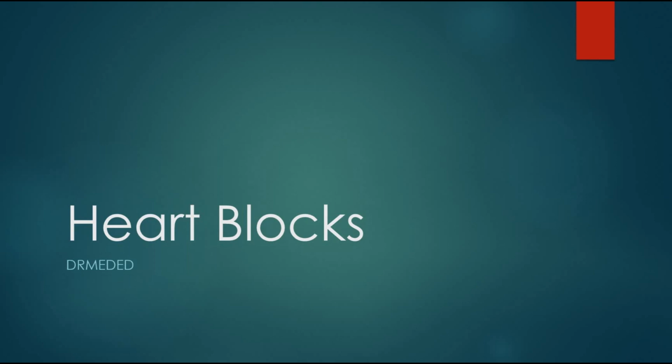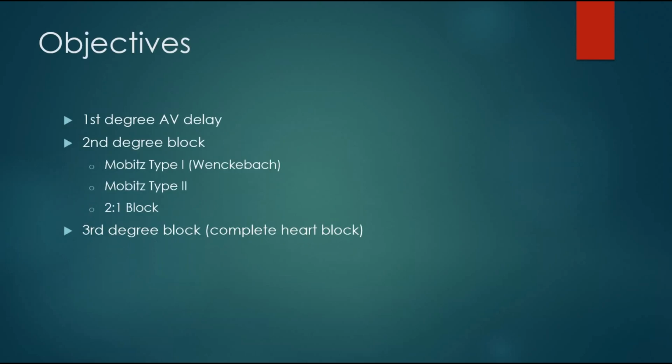Today we'll talk about heart blocks. We will talk about first degree AV delay, second degree blocks, that includes Mobitz type 1, also known as Wenckebach block, Mobitz type 2, and 2 to 1 block, and third degree heart block, also known as complete heart block.